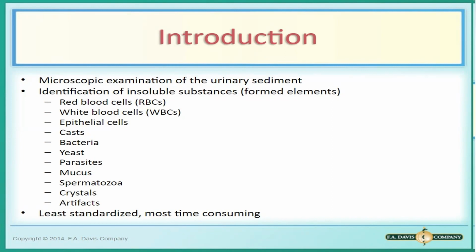Syempre, yung elements, yung cells, they move around. So, hindi yan 100% equally distributed. Siguro yung part na nabasa mo, maybe marami kunyaring sediments, maraming elements. Yung part na mababasa ko is wala masyado. So, yung reporting natin, in the end, is still different. Okay? So, that's one way.